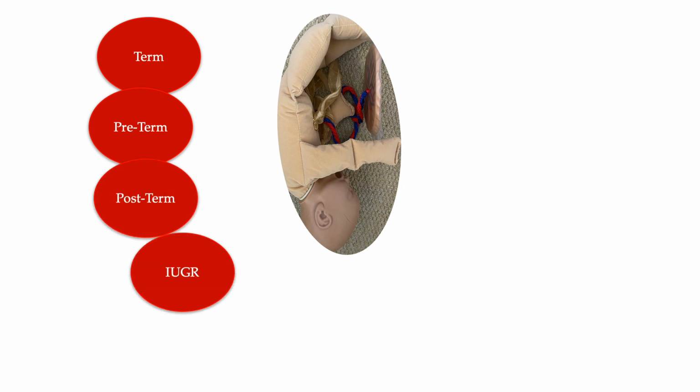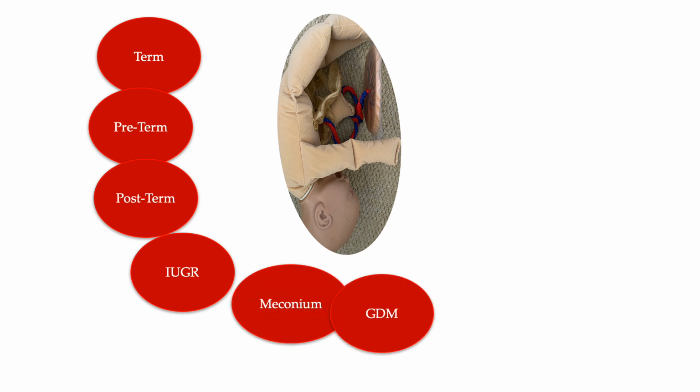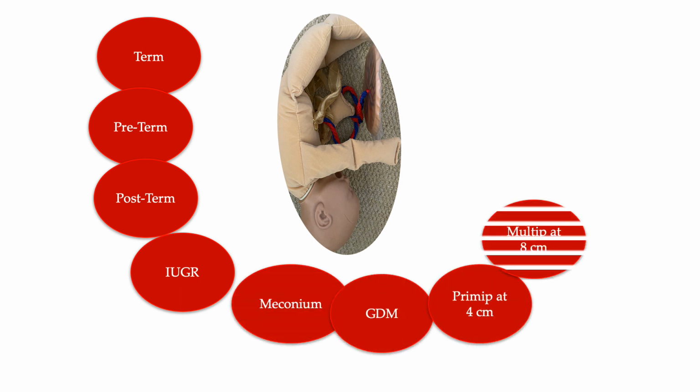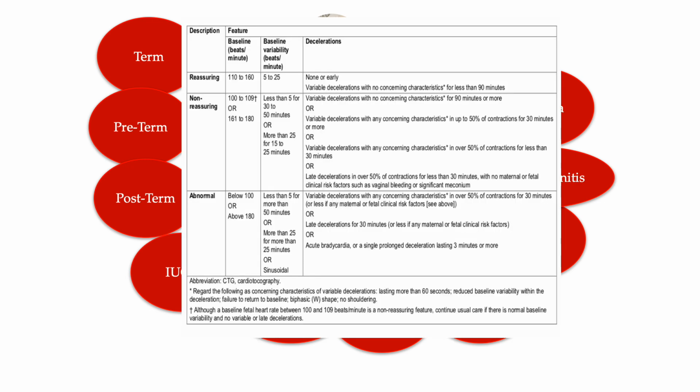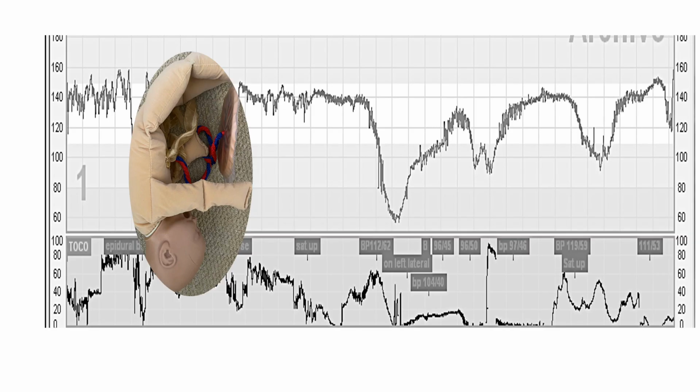They have different background risk factors, different compensatory responses, and different physiological stress to withstand the stress of uterine contractions. Therefore, it's not surprising that the use of one CTG guideline with set parameters and time limits is unlikely to work well during human labor. So physiological CTG guidelines are meant to understand four key principles while interpreting the CTG traces.